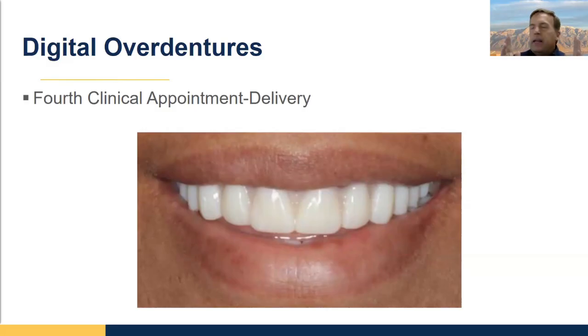One thing to keep in mind, in general, the more parallel your implants are, the less wear and tear on the attachments. And you'll also make sure you coach your patients on inserting them by hand rather than biting them to place. That will help with the maintenance, with the attachments lasting a little bit longer.